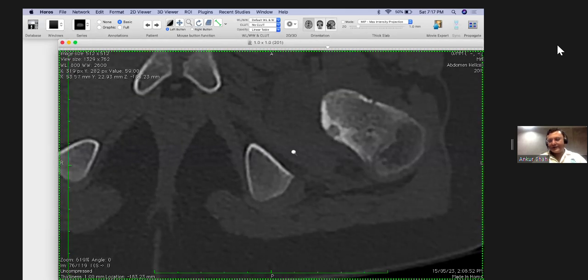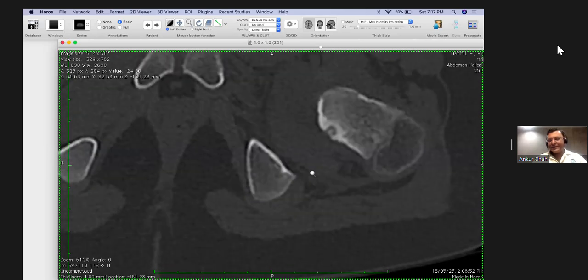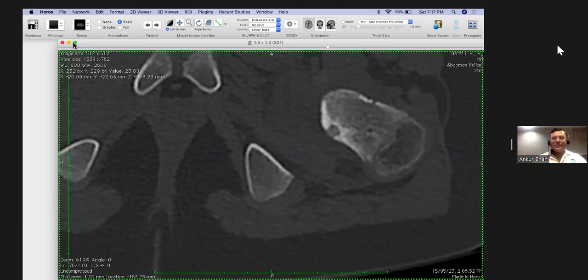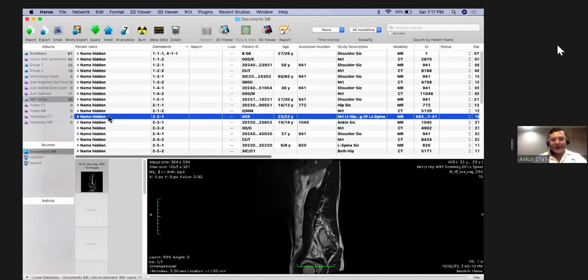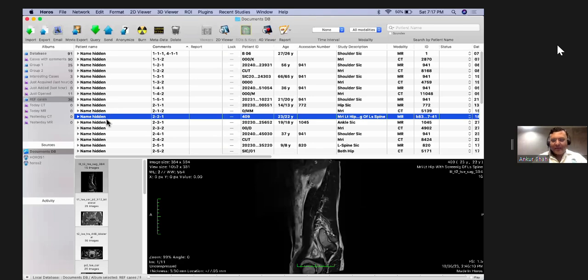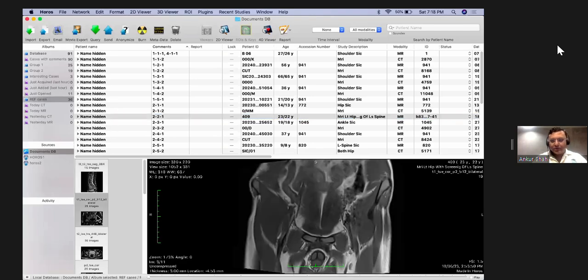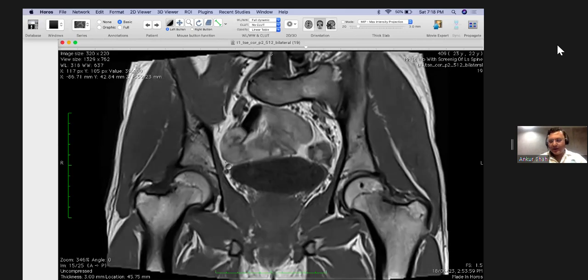You can see the nidus, you can see the area surrounding it, a small osteolytic lesion with the central nidus, and this is the very classical appearance of osteoid, but they can be very much misleading on MR. It might be initially thought of as an infective lesion or any other abnormality very frequently, and that is why it is important for us to look for those areas, not just once. We have burnt our fingers multiple times.